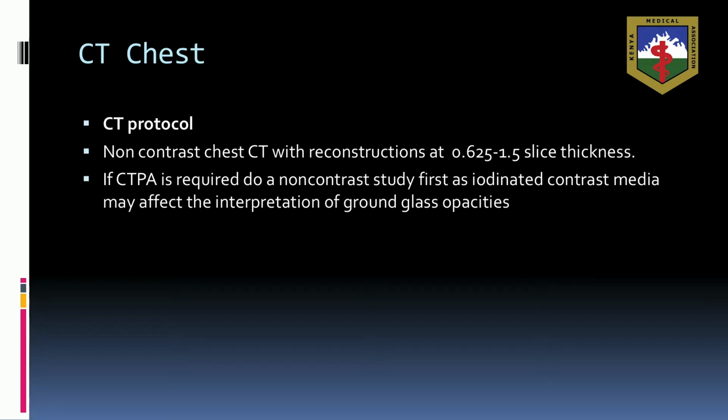Now, if you do require to do a CT pulmonary angio where thromboembolism is suspected, a pulmonary embolus is expected, then you do a non-contrast study first, as iodinated contrast media may affect the interpretation of the ground glass opacities.